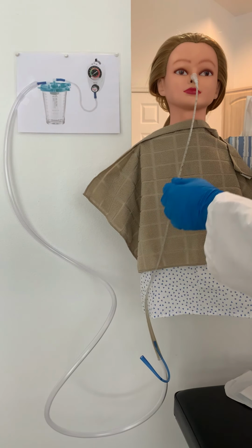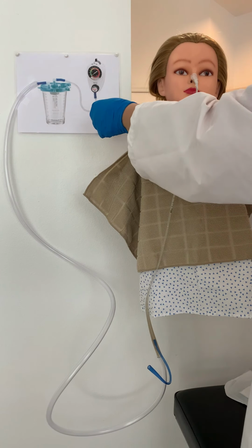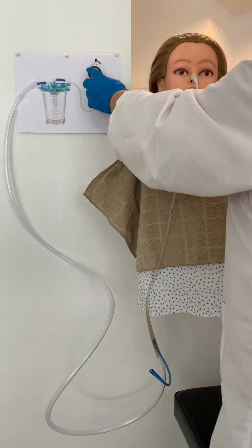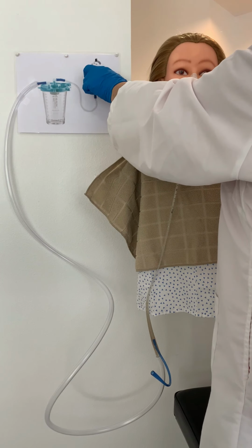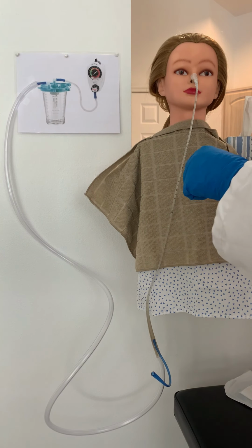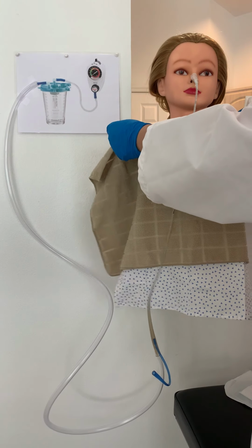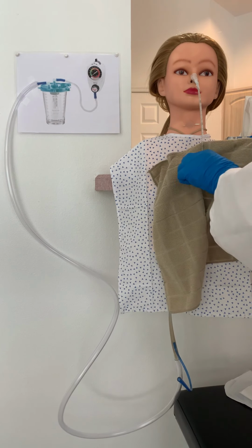And then we will turn on the suction. So we want it to, I think our order says low intermittent. So I'm going to flip that switch to intermittent, and I'm going to turn this up to that low area somewhere in that green range. Okay. Are you feeling okay, Mrs. Harper? All right, this should really help.